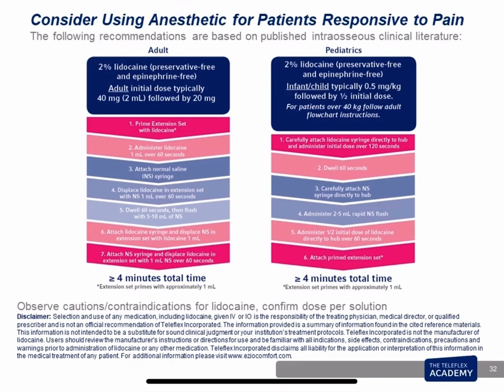You'll switch to a saline syringe and administer the second ml of lidocaine, which is still in the extension tubing. And that way you've given 2 mLs of lidocaine over 2 minutes. It's recommended that you allow that to dwell for approximately 60 seconds. I like to say let it marinate.